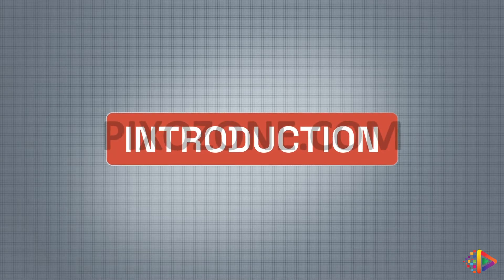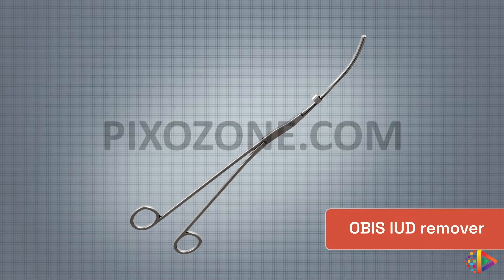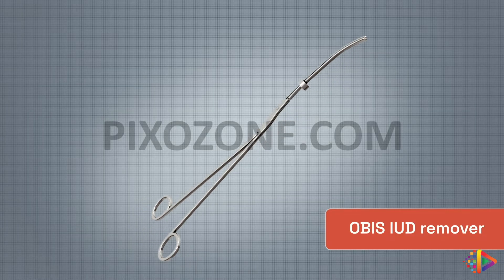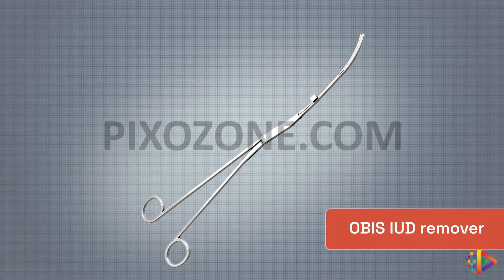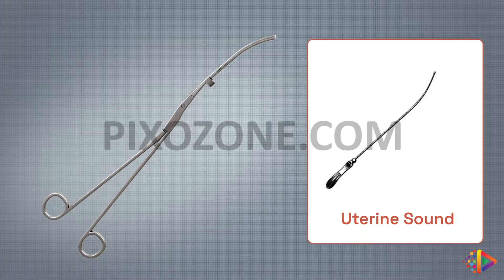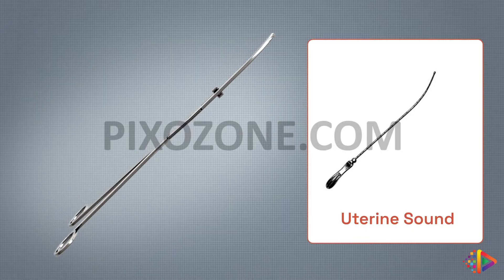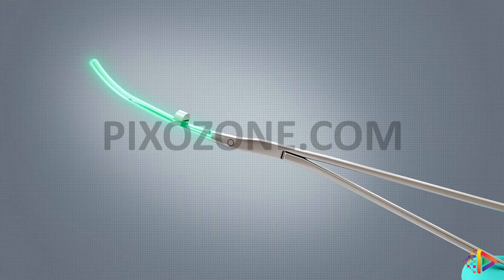Welcome to this instructional video on using the OBIS IUD remover. The IUD remover has been designed to safely and effectively retrieve a trapped IUD by taking the physician's comfort level into consideration. If you can sound the uterus using a uterine sound, you can also use the OBIS IUD remover. The design of the IUD remover also takes into consideration the patient's comfort and safety.